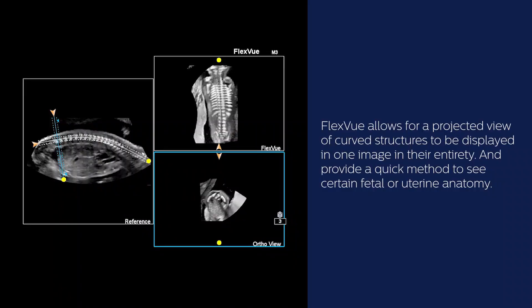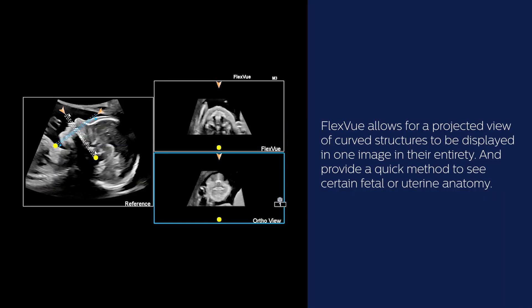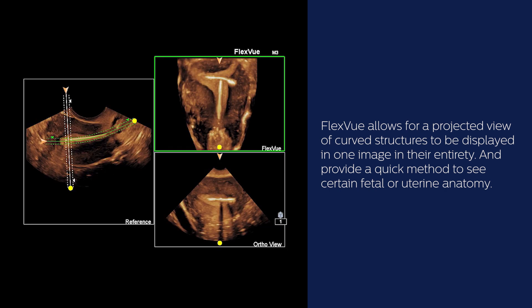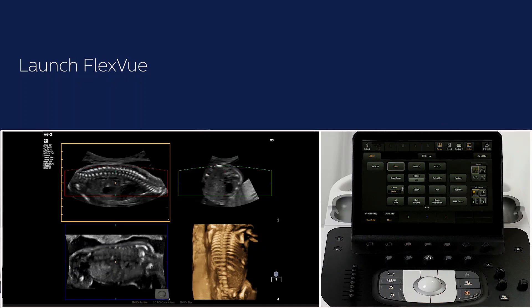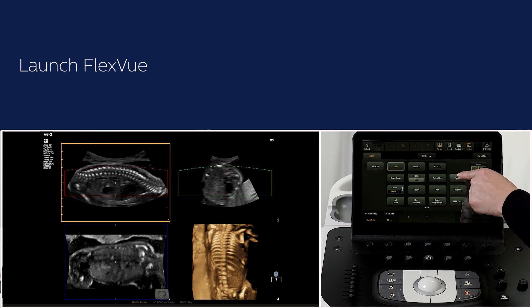FlexView allows for a projective view of curved structures to be displayed in one image in their entirety and provides a quick method to see certain fetal or uterine anatomy. Following a 3D acquisition — here an example of a fetal spine — FlexView is activated on the touchscreen.